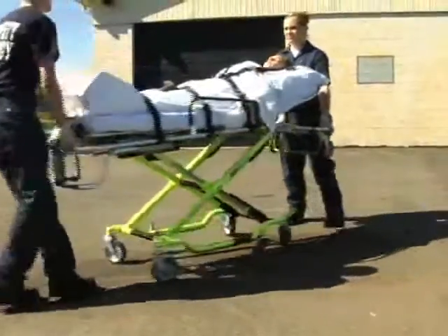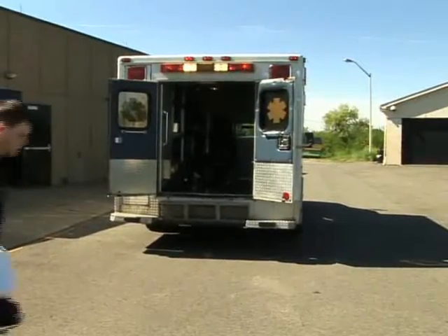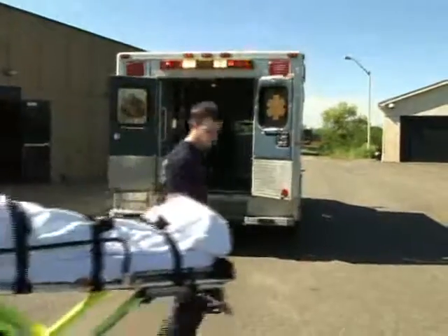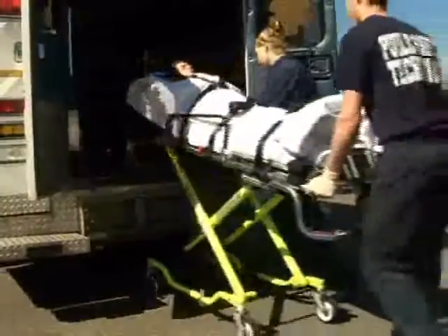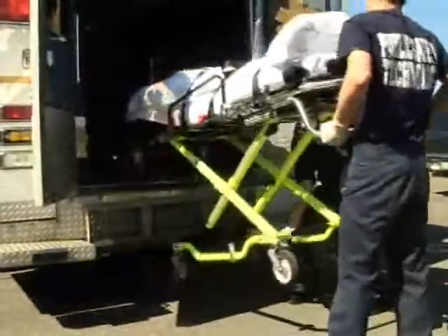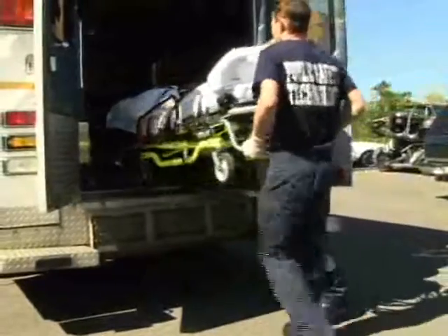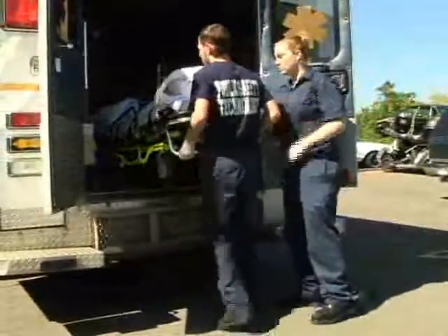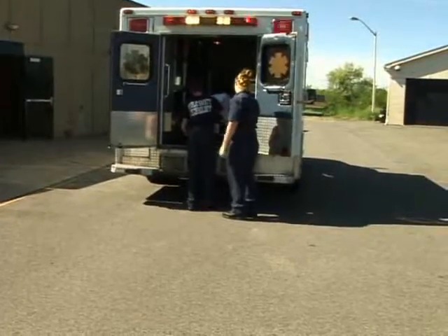With one person at the foot and another at the head, position the cot to the desired location. Place the wheels onto the platform, lift the cot and release the locking mechanism. Your partner lifts the undercarriage, then roll the cot onto the ambulance and lock it in place.